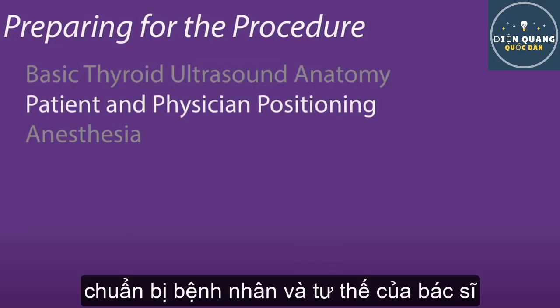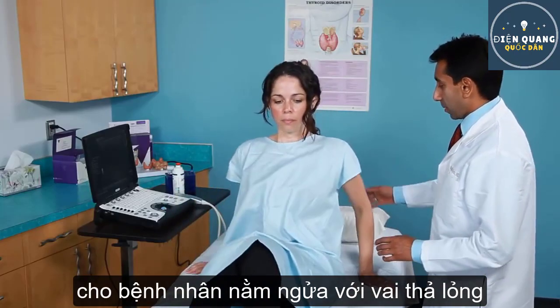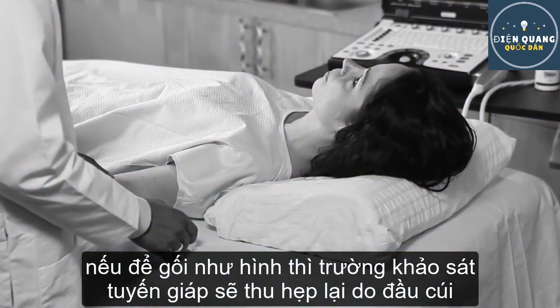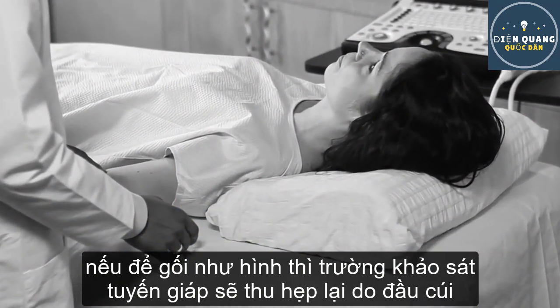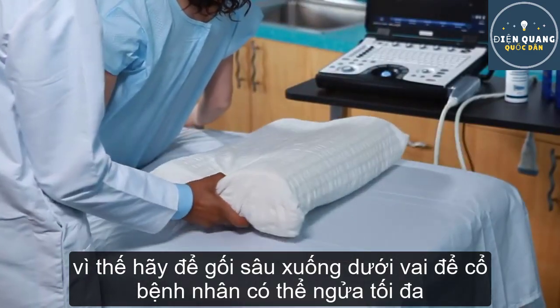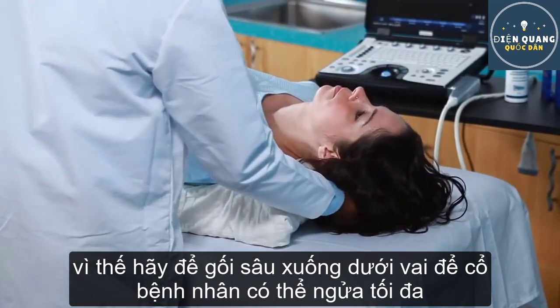Patient and Physician Positioning. Place the patient in a supine position with the neck slightly extended. A pillow, if used, should not be placed under the head, which actually flexes the neck and limits exposure to the thyroid area. Instead, the pillow should be placed under the patient's shoulder, which extends the neck and allows full access to the area of interest.